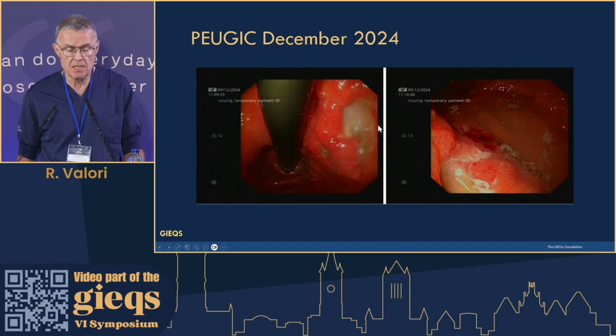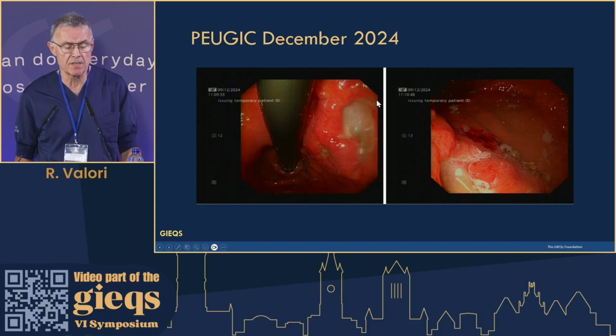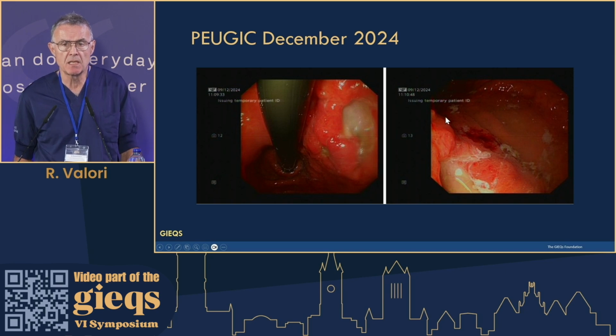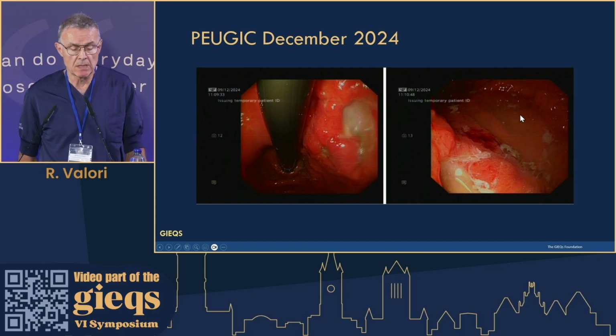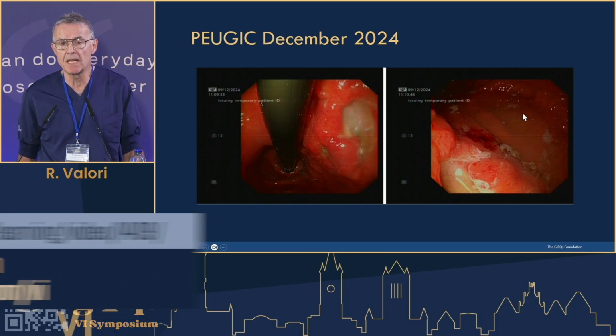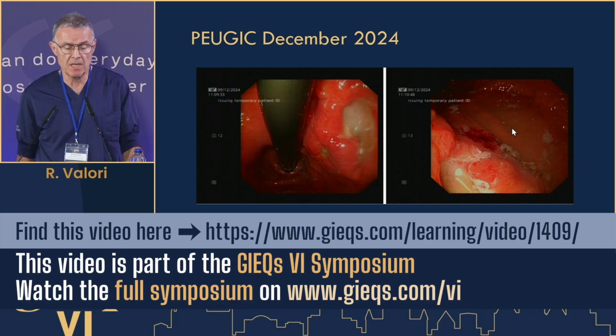Now, this patient had a complete gastrectomy, and the cancer was widely infiltrative into the esophagus and into the local lymph nodes as well. So the question is, did this patient have a lesion 7 months previously, and had it been diagnosed then, could this cancer have been prevented? Is this an entirely new lesion? My take-home point here was the images that were taken in the previous endoscopy are completely inadequate to tell you whether there was something there or not.